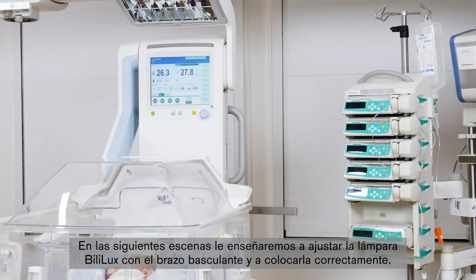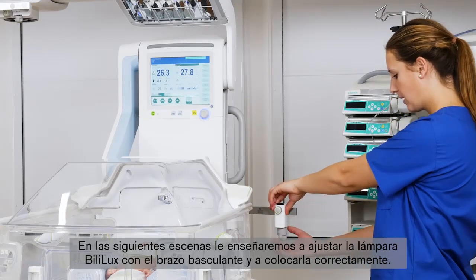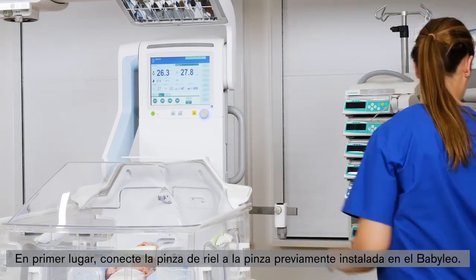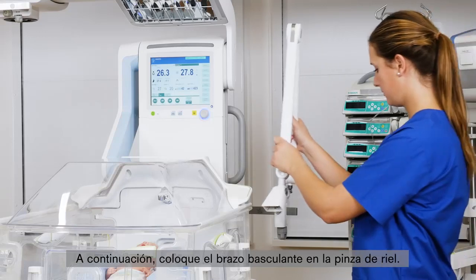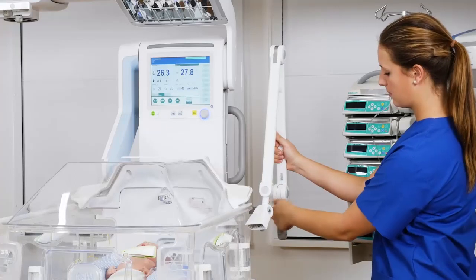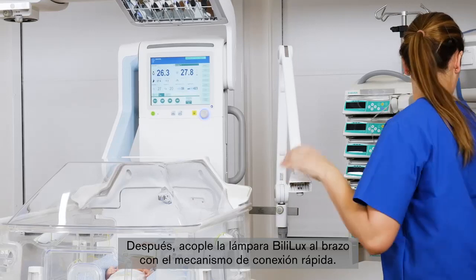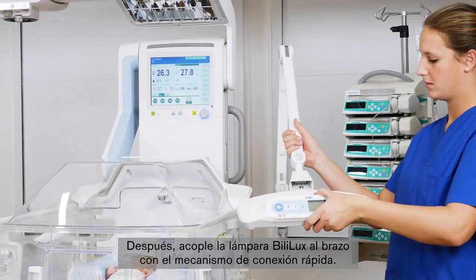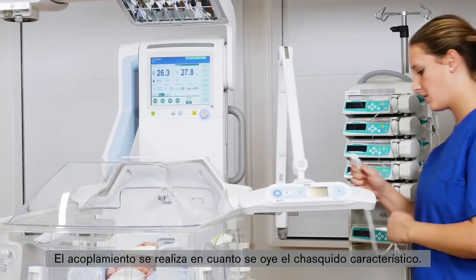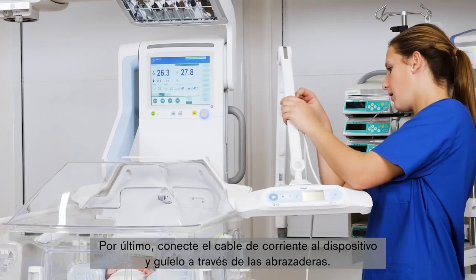In the following scenes, we will show you how to adjust the Bililux with the spring arm and how to position it correctly. First, attach the rail clamp to the clamp already mounted at the Baby Leo. Take the spring arm and place it into the rail clamp. Then take the Bililux and attach it to the arm by using the quick connect mechanism. As soon as you hear the clicking sound, the connection is fixed. Finally, attach the power cord to the device and guide it through the cable clips.